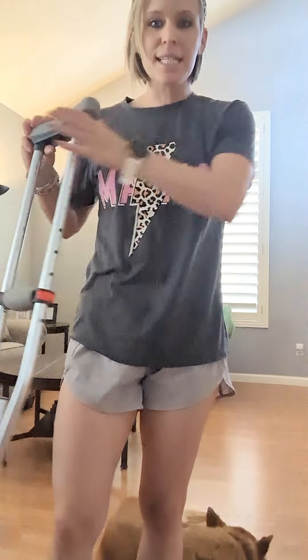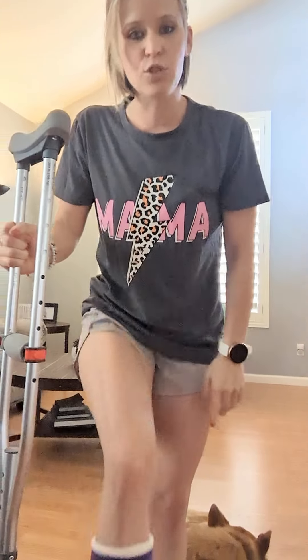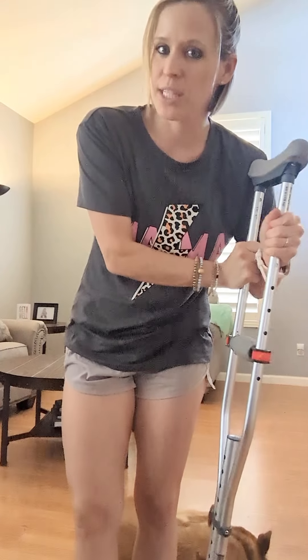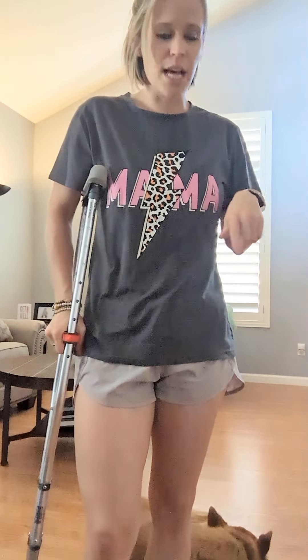Let's talk about what side the crutch goes on. The temptation a lot of times is to put the crutch or cane on the same side as the affected extremity. We don't want to do that — we actually want to put it on the other side. This may seem counterintuitive because people think they'd want it on the side they're trying to take pressure off of. But what I see is people end up dumping their weight into it or sagging down onto the crutch. Generally, the crutch needs to go on the other side.